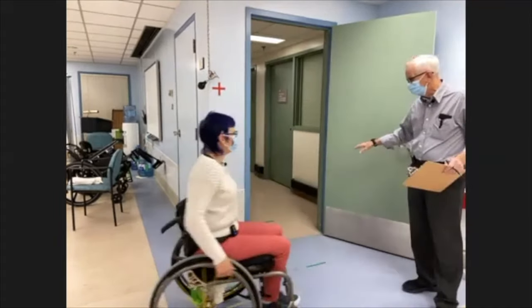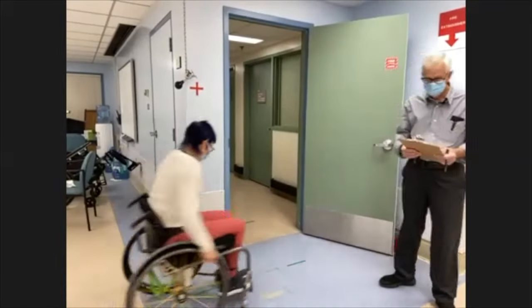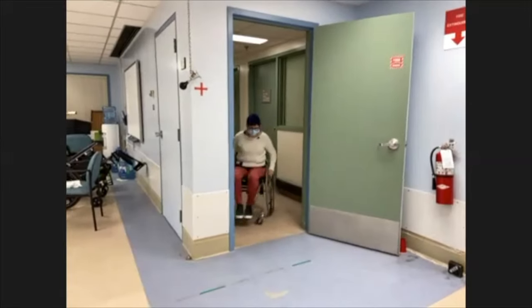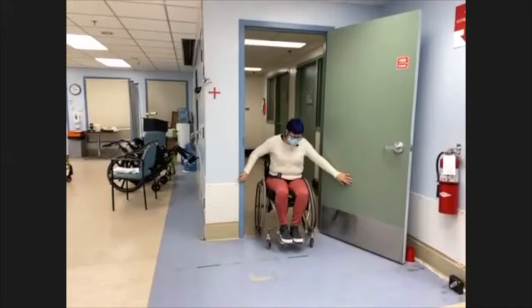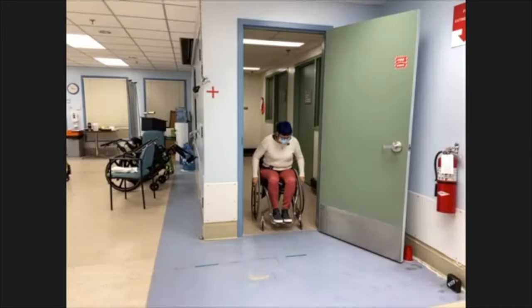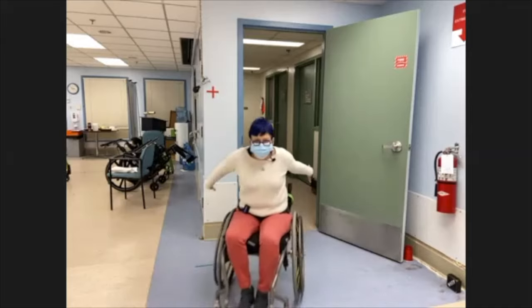Sierra uses the slingshot technique automatically. Rather than pushing multiple times — opening the door, holding it open, and pushing with alternating hands — she uses the environment instead. Once she gets her hands on two different objects, she acts as a slingshot and brings herself through in one motion.